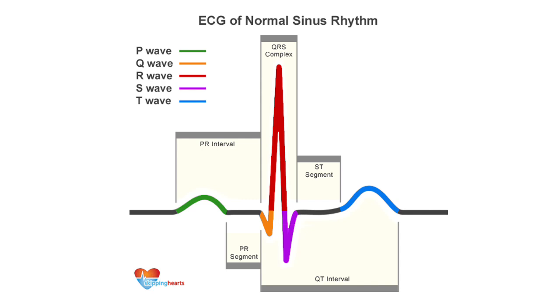One common question that pops up, or misconception that pops up with students, is about the naming of the QRS complex, which wave is which. I've had questions about this before. It's important to recognize that in the QRS complex, some students often have the misconception that the very first deflection, no matter which direction the electrical activity is going, is called a Q wave. That is incorrect.